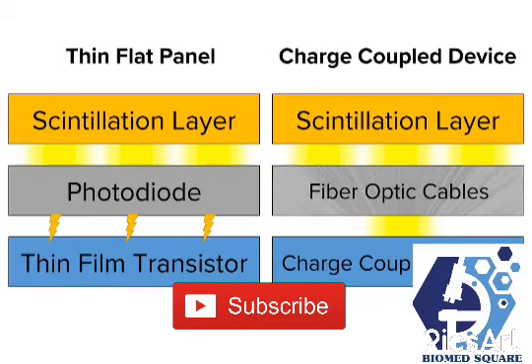The image receptors used in digital fluoro are similar to the image receptors used in digital radiography. They're either thin flat panel or charge coupled device.